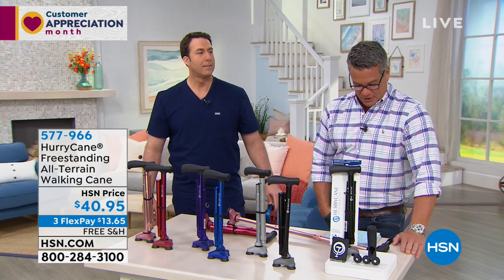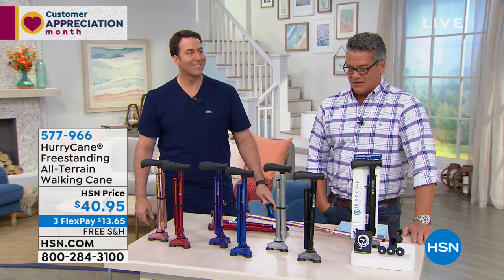And this HurryCane, which many of you have seen on an infomercial, it's been around for a while for good reason. It's not just a fad. It's a really top-of-the-line product — what I call the smartest cane on the market.